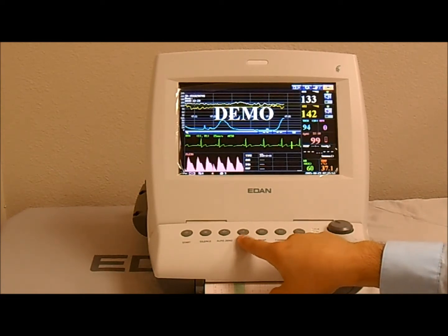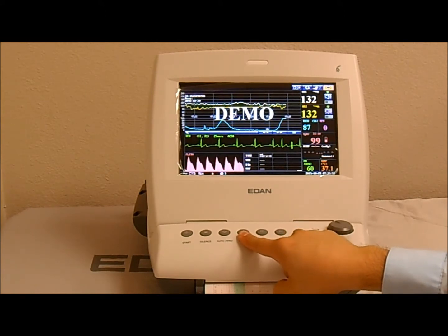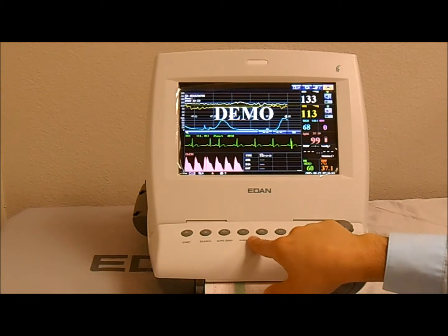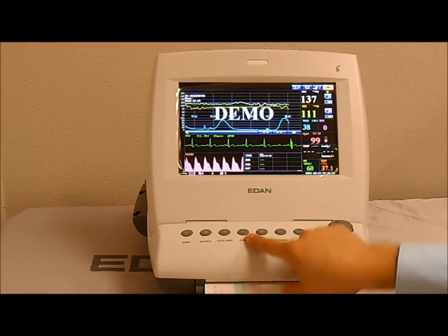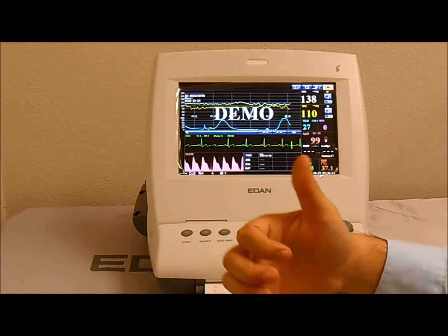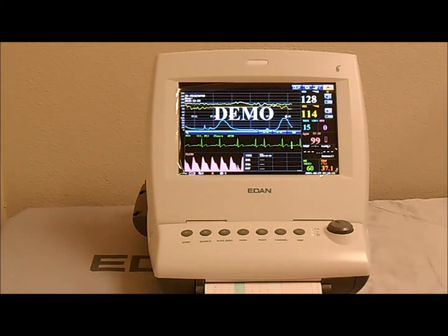Okay, next we have the mark key. If you press it, this will place a marker on the CTG waveform. By pressing the mark, you're going to have an arrow pointing down, and this means that this was a clinician mark. So we have the mark right here. If the patient presses the remote marker, it'll give you an arrow pointing up. So that's the difference between the two.